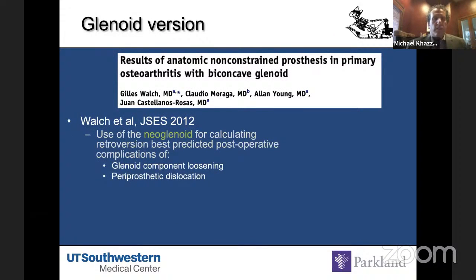Why is this important? Because if you do not assess these things, Walch found that if you do not correct the biconcavity in the anatomic setting, you get increased risk of failure, and instability.